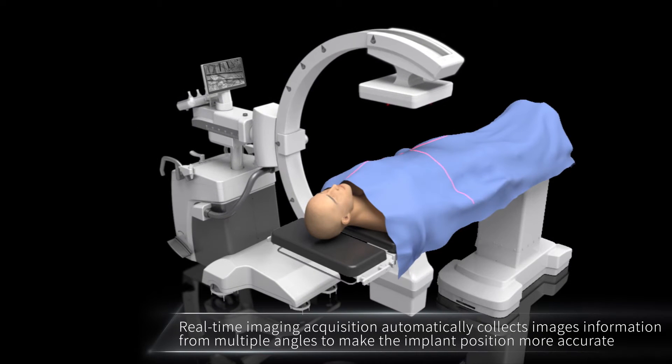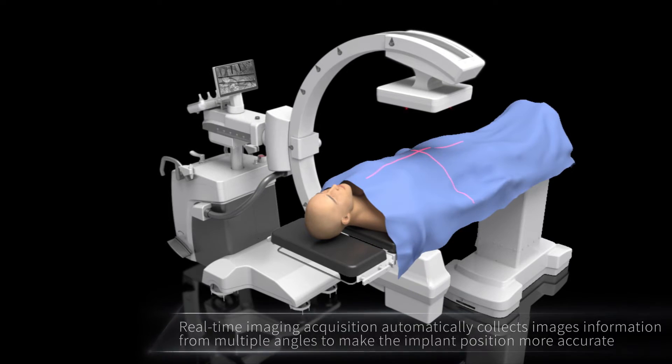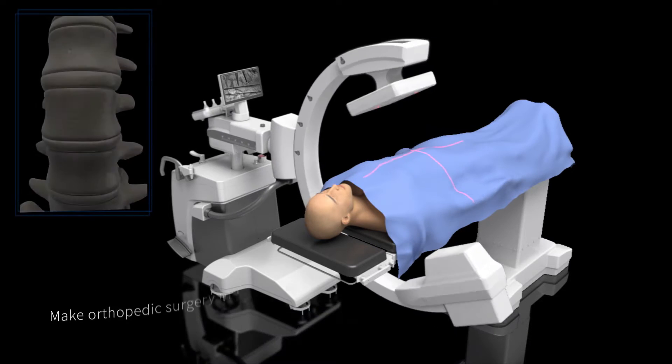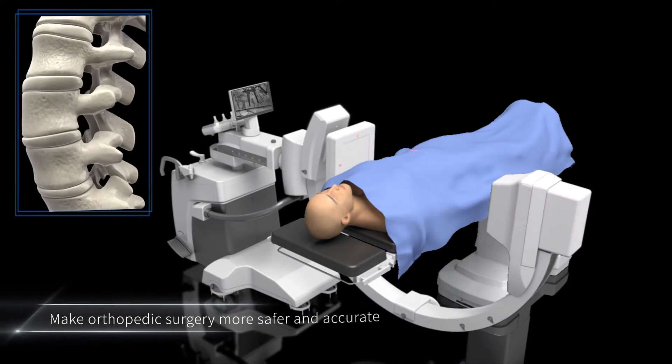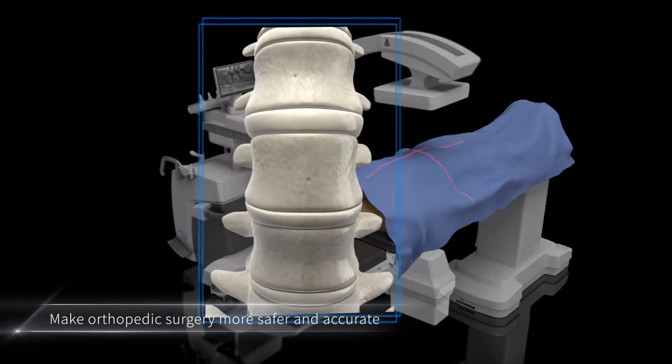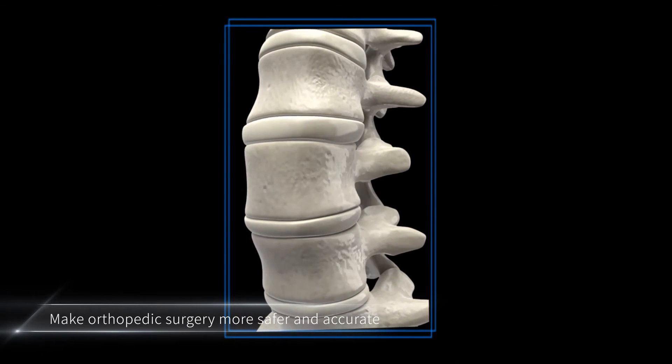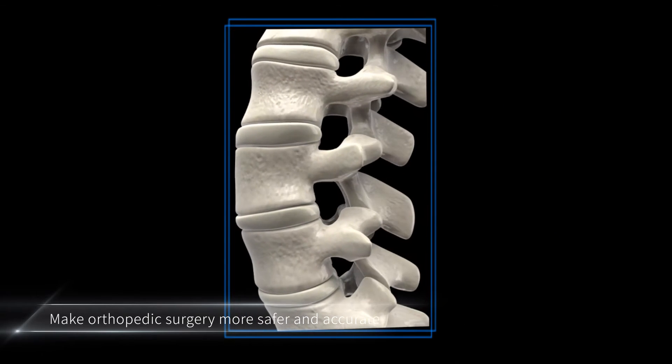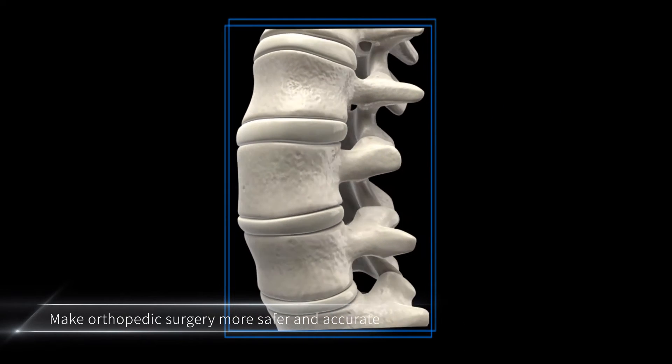3D image rotating acquisition restores the real anatomy. This lets doctors learn more about tissues and makes implants more accurate.